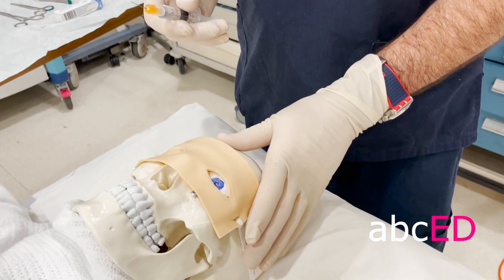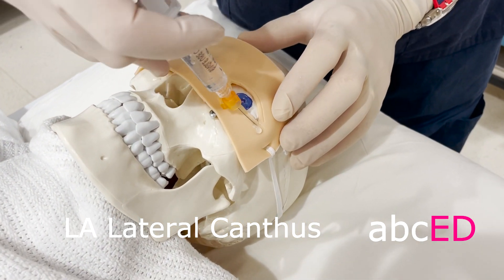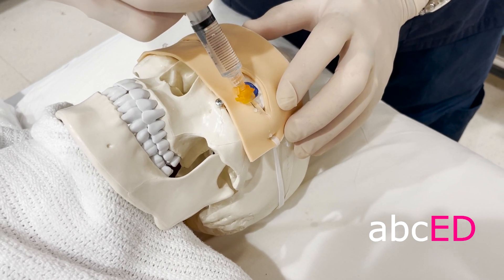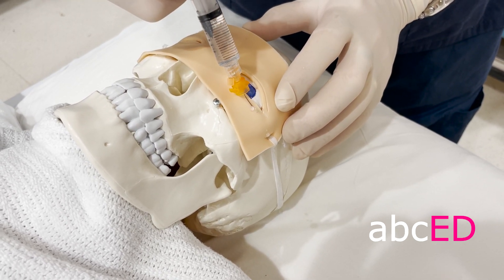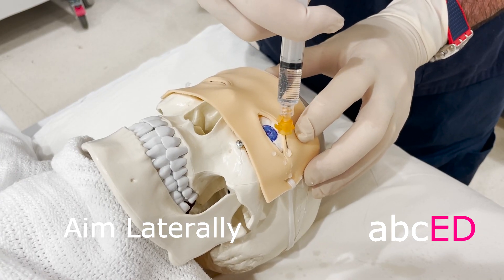Consider sedating your patient before we do this. I'm going to infiltrate the area around the lateral canthus, aiming away from the globe at all times.